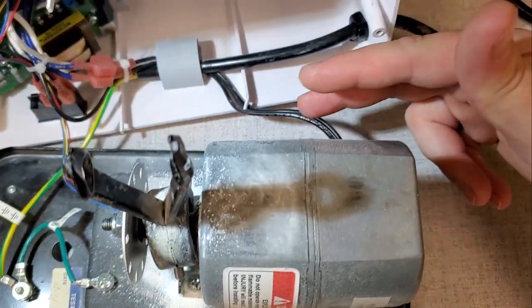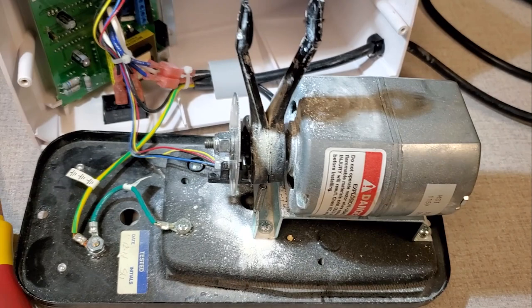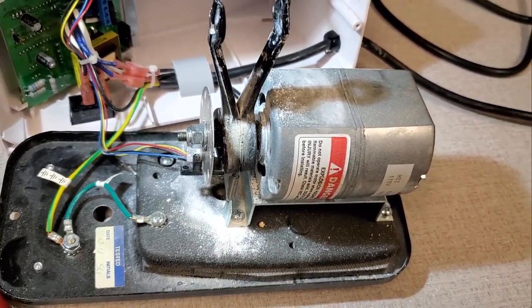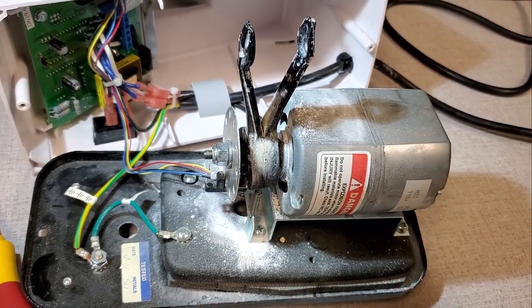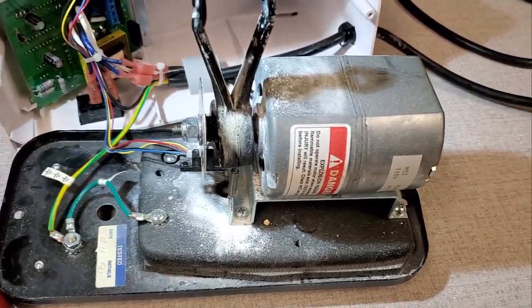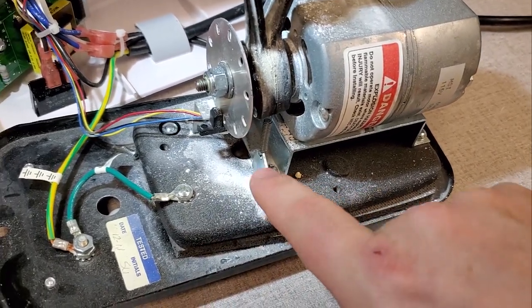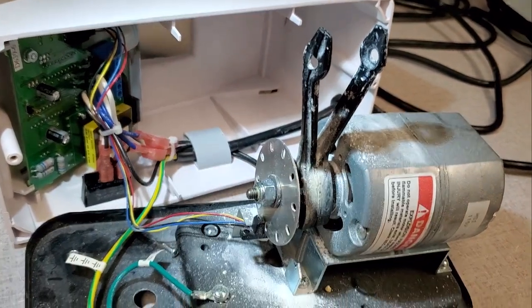So to test this one, you could actually just hook up your multimeter on AC and hit the go, and if you have 115 volts or 110 volts AC, you know that the motor's at least being told to turn on, and if it still doesn't, obviously those brushes would be suspicious. You can see on this motor here, it's got a white powder all over the place, and that's because of debris that comes in from the mixer.